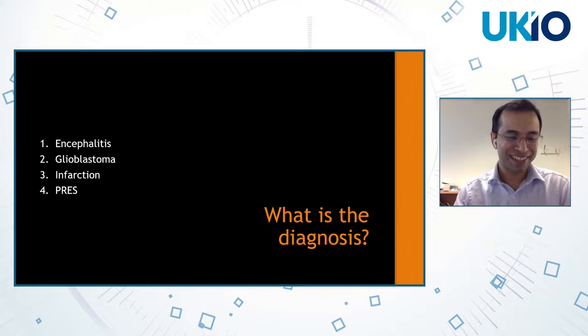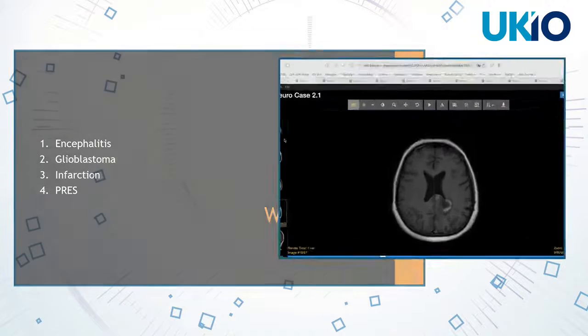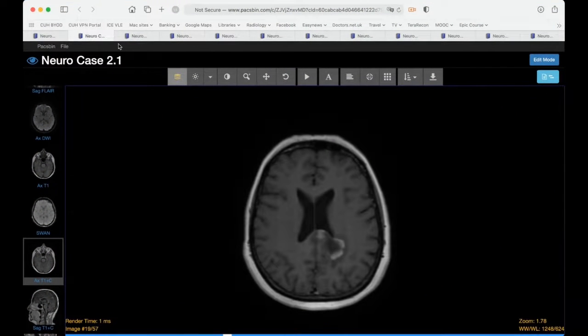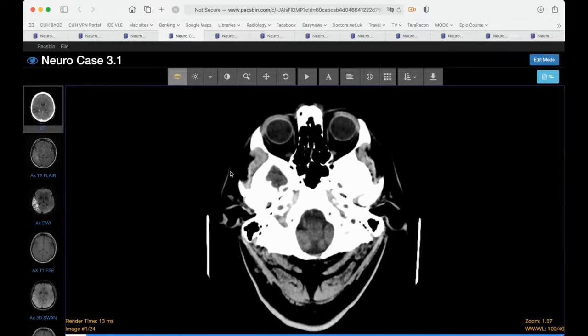Sorry. Right. So hopefully you should be able to see that now. And we're looking at the moment at case 3.1.